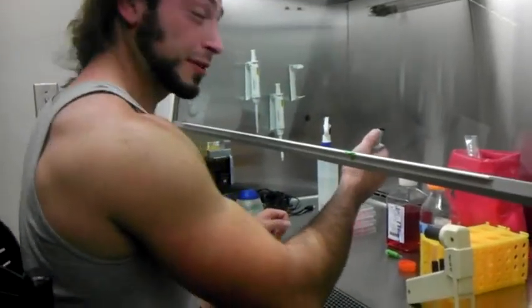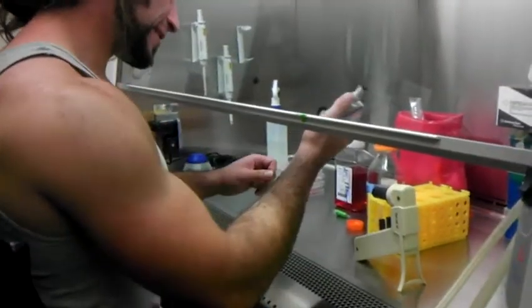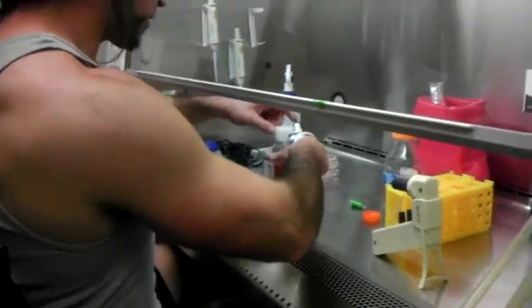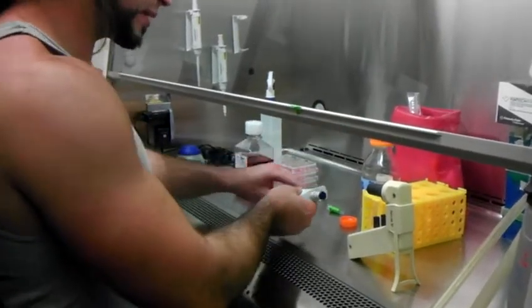Don't lose count. You ready for this? You need to count with it. Alright, 28.2. And we're using the DMEM without the FBS. Alright, let's get a tip on this thing.